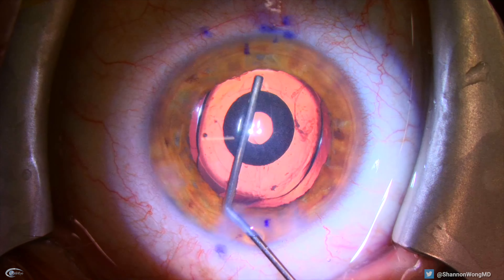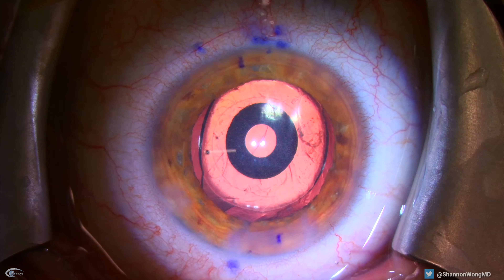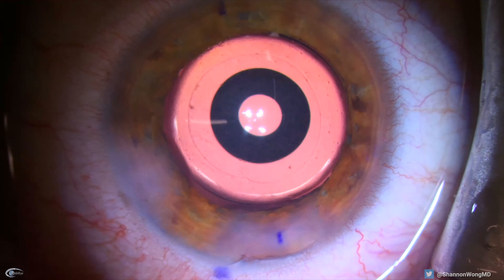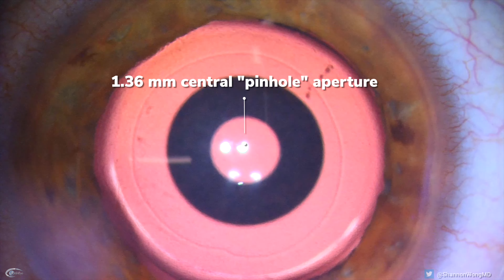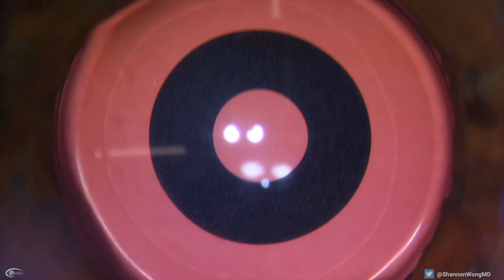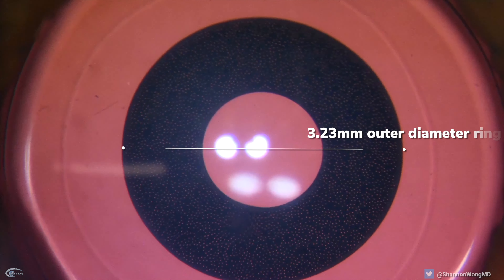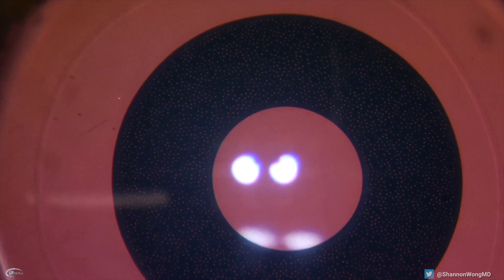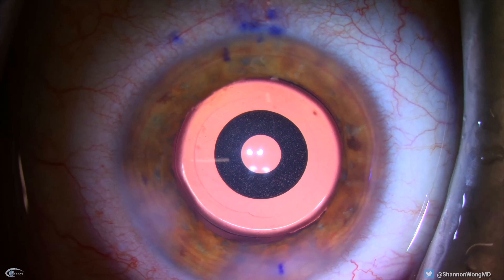I can foresee the silicone tip of this injector potentially grabbing the iris in some situations. This is a close-up view of the lens through our surgical microscope. We can see the 1.36 millimeter pinhole aperture opening in the middle of the lens, which is 6 millimeters in diameter. The outer diameter of the black filtering ring is 3.23 millimeters. Zooming in on the filtering ring, which is embedded within the clear acrylic material of the lens, we see that the ring has a slightly porous consistency with thousands of tiny holes within the ring.